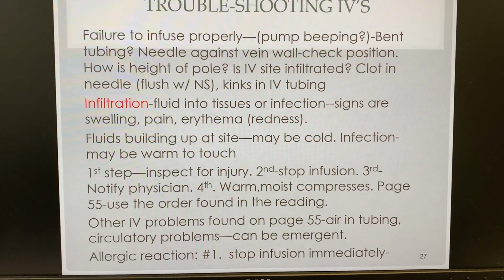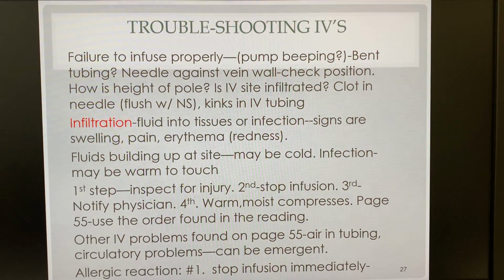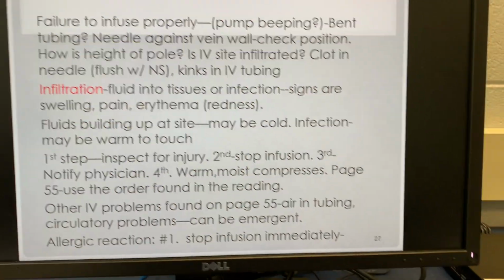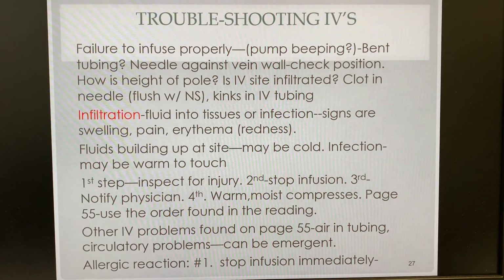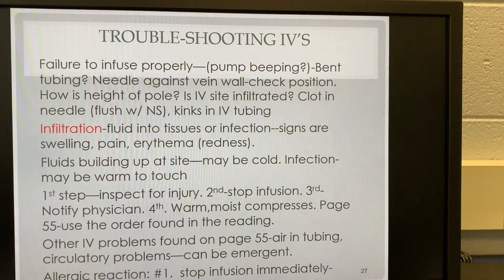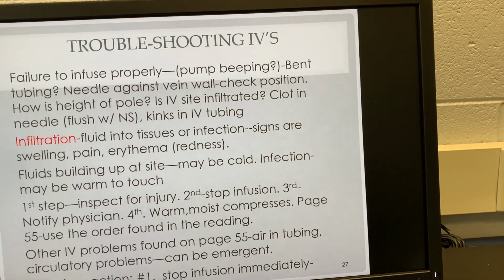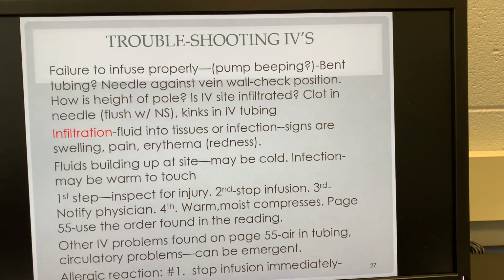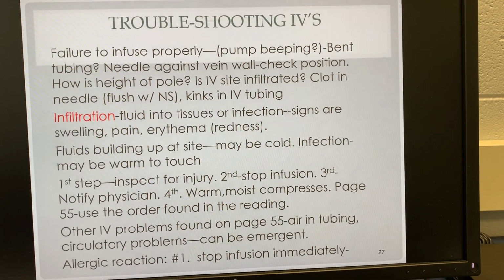Hint, hint, hint. Step 1 is inspect for injury. Now somebody says, well, why don't you stop the infusion? Because you want to look and see what you're dealing with first. You don't necessarily want to stop it if it's just uncomfortable. Some people will complain about an uncomfortable IV, even though it's not infiltrated or there's no problem. It's just hurting them. It is uncomfortable. You've got a plastic thing in your vein and there's fluid going in it. So look at it first.